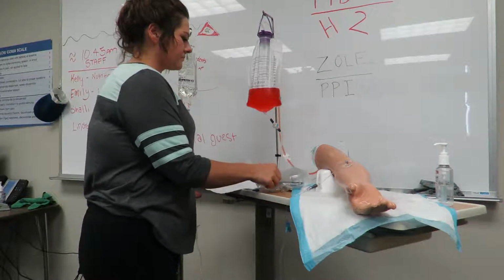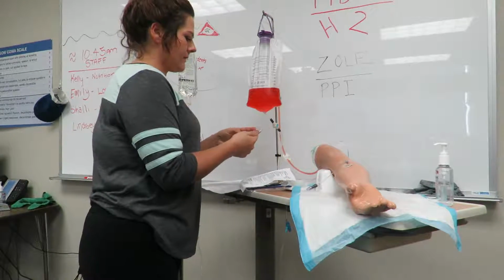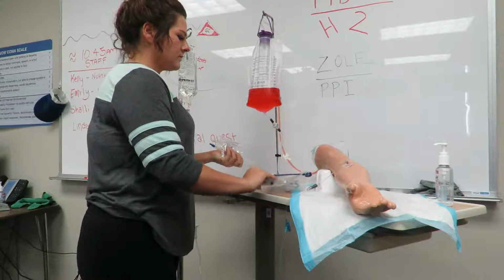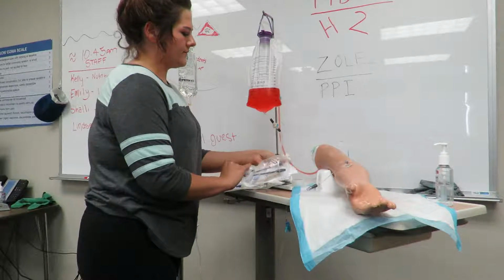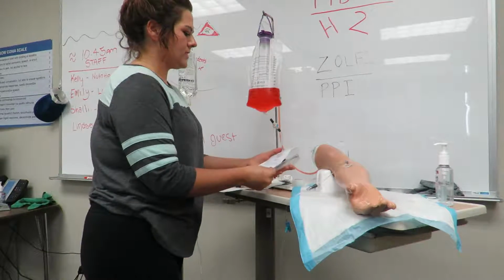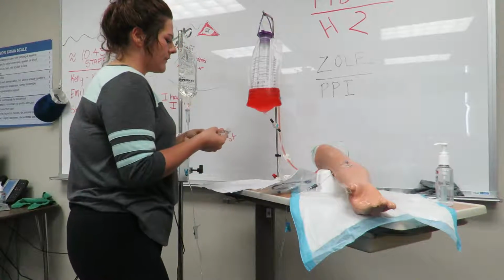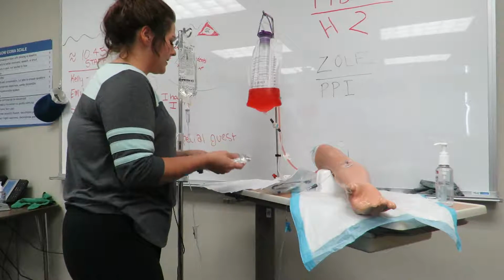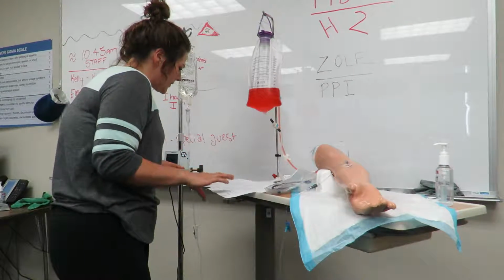And I have my tubing and my antibiotic here. My tubing is intact, hasn't been opened, it's new. It'll be used for the first time. Expiration date's good on that. And my expiration date and integrity of my antibiotic is good. We're going to be doing the first check of my MAR here.